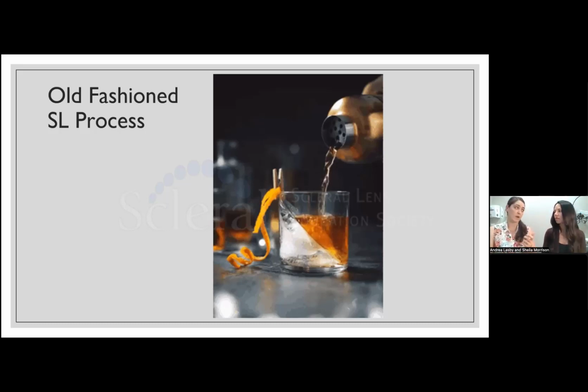With that white light, it's the best way to be accurate with your measurement. So if you don't have an OCT, the best way to be as close as you possibly can is with white light, because with blue light you will miss it, especially when you're looking for really small 20 micron limbal clearances. It's nice to look at it in gross detail, but when you're looking to take a true measurement, we want to look with white light.